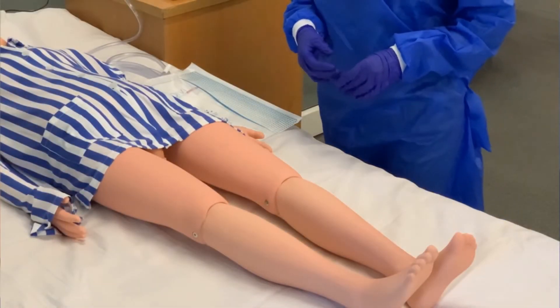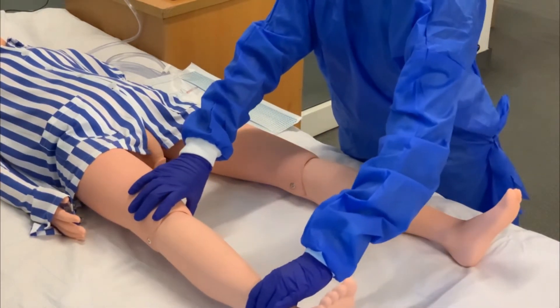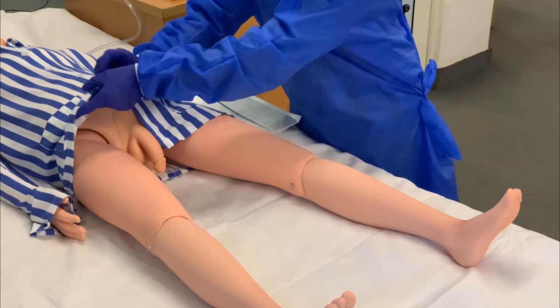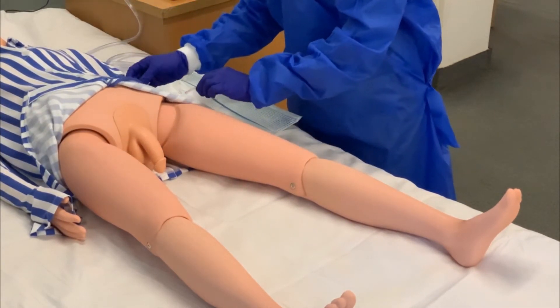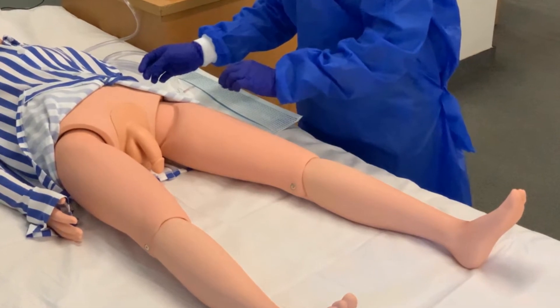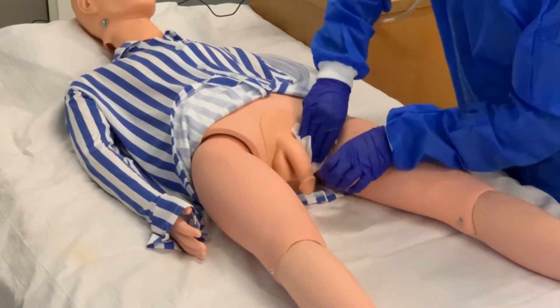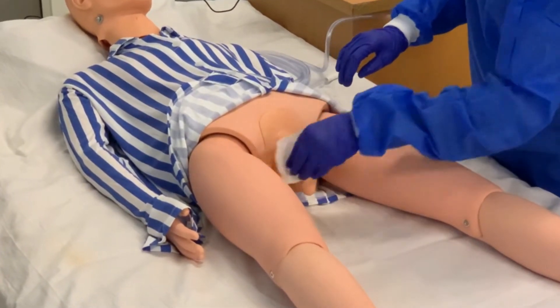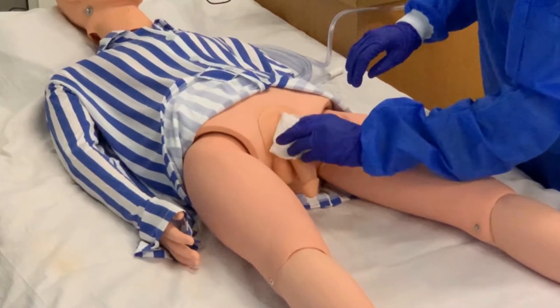Flatten the bed and turn the patient into supine position. Move the legs of the patient slightly apart from each other and position yourself so that the urogenital region is clearly visible and easily accessible. Perform perineal care to clean the anatomy and pat the skin dry to remove any moisture. This helps in getting a good seal of the adhesive patch around the anatomy.